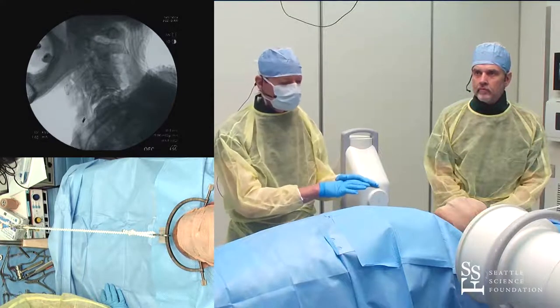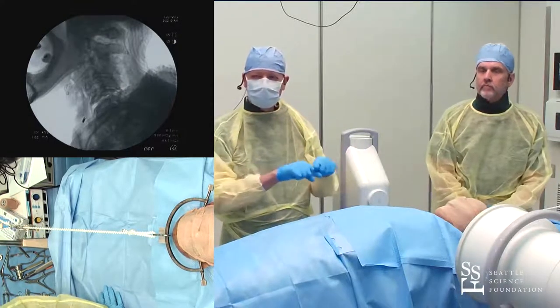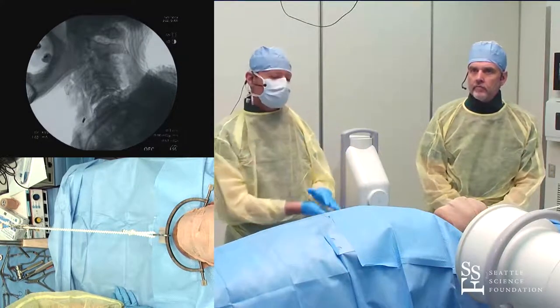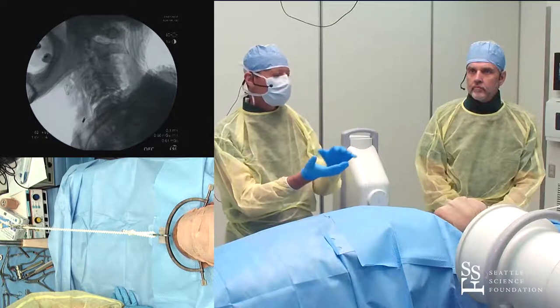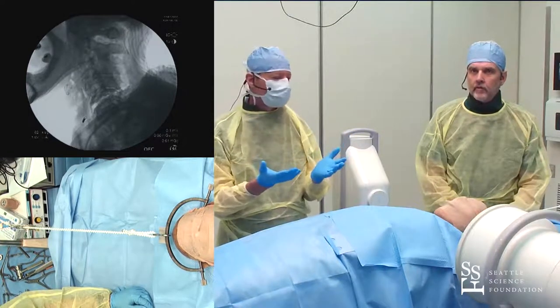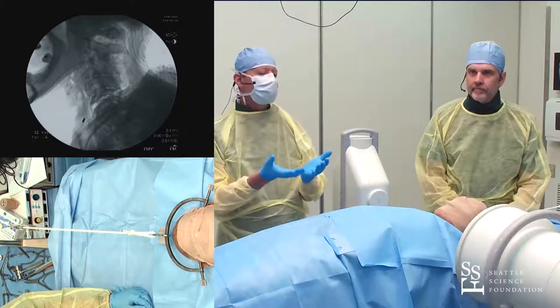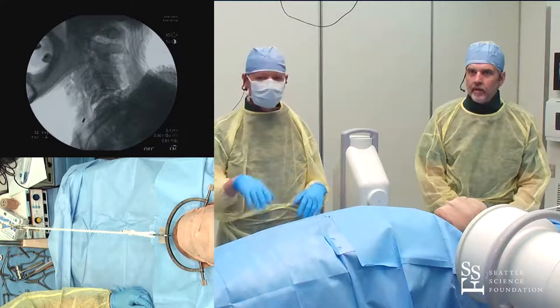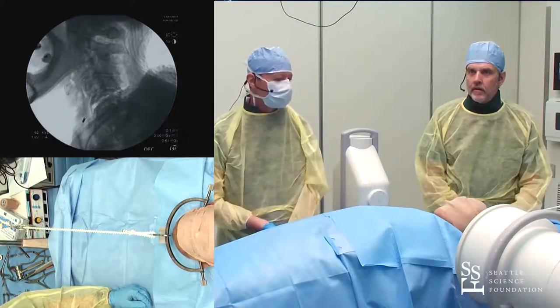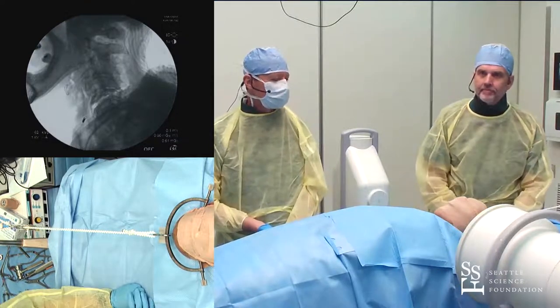Maybe a comfort pillow under the head. Once you've distracted and reduced, then extend the patient — put a roll under the shoulders — and you can take the weights way down because now you're stable. Once it's reduced, you don't need a lot of weight. Keep them extended and they should be stable to transport around the hospital, get MRIs, go to the OR, or whatever. The facets are locked in the extended position and should be stable.